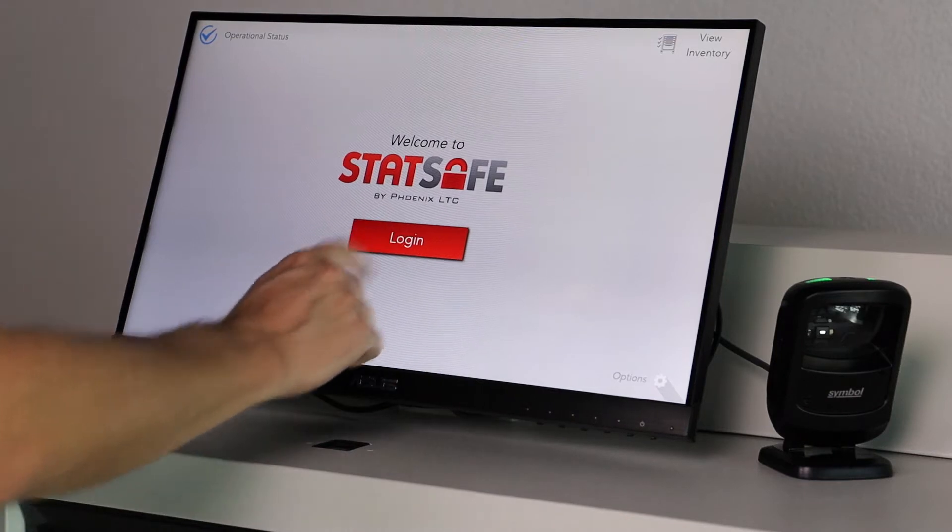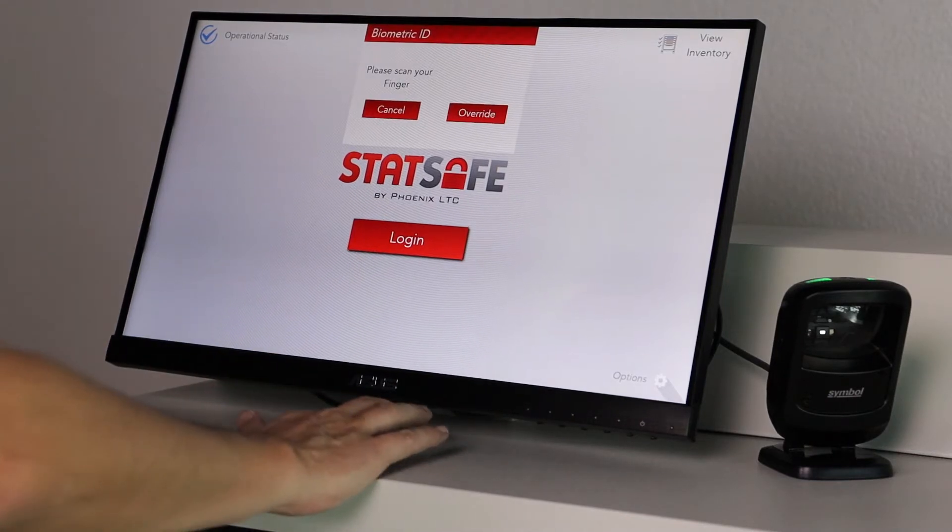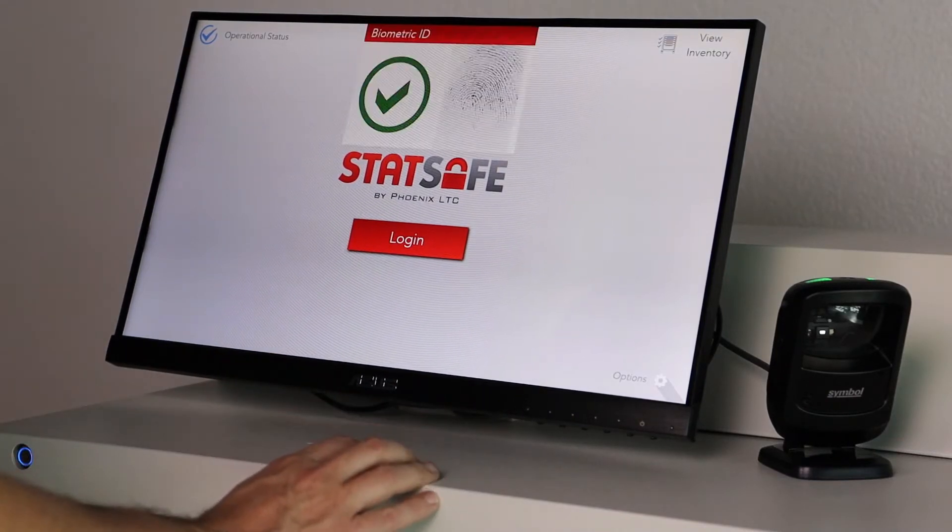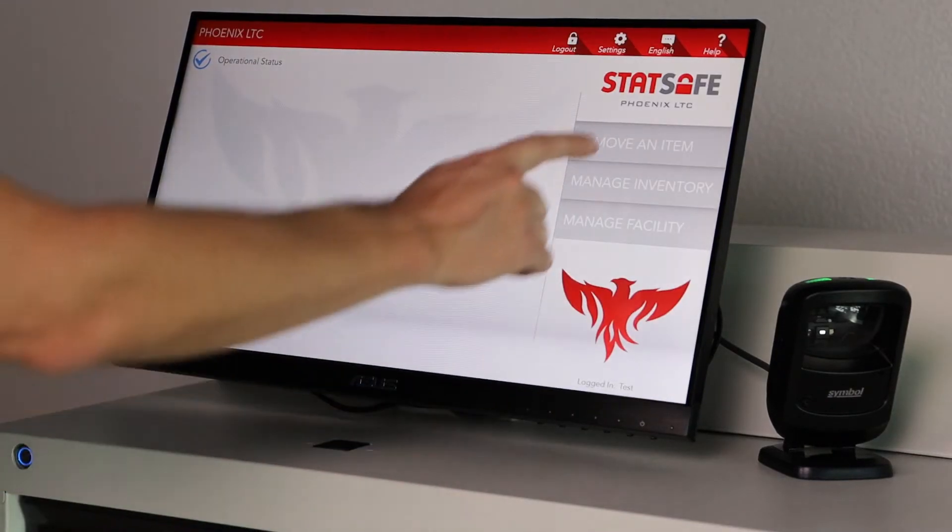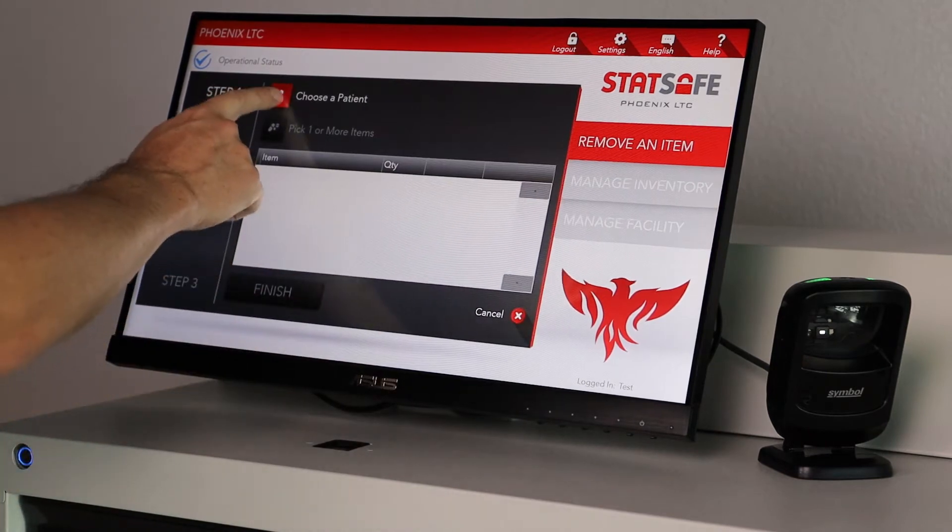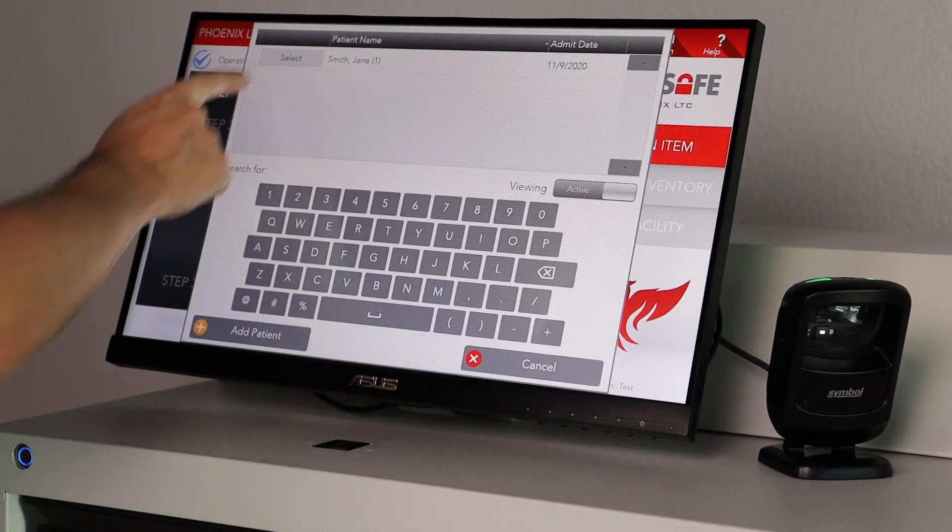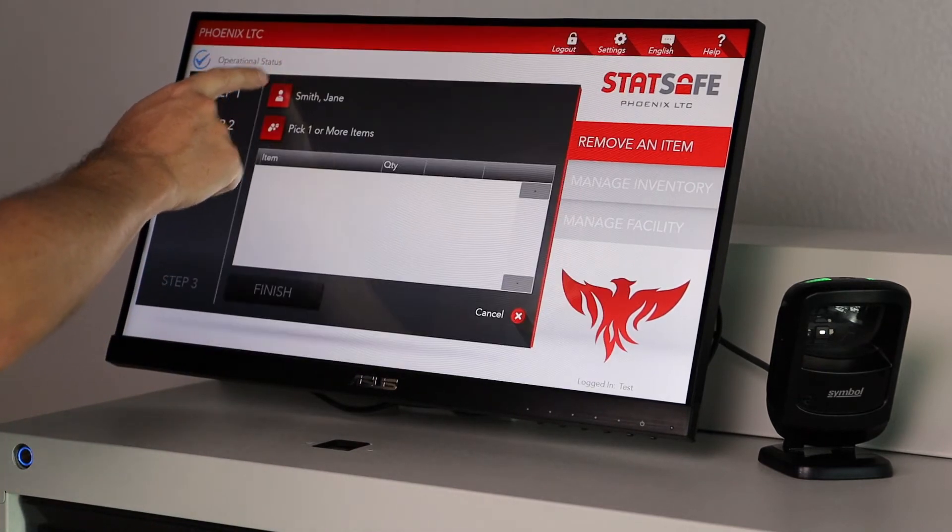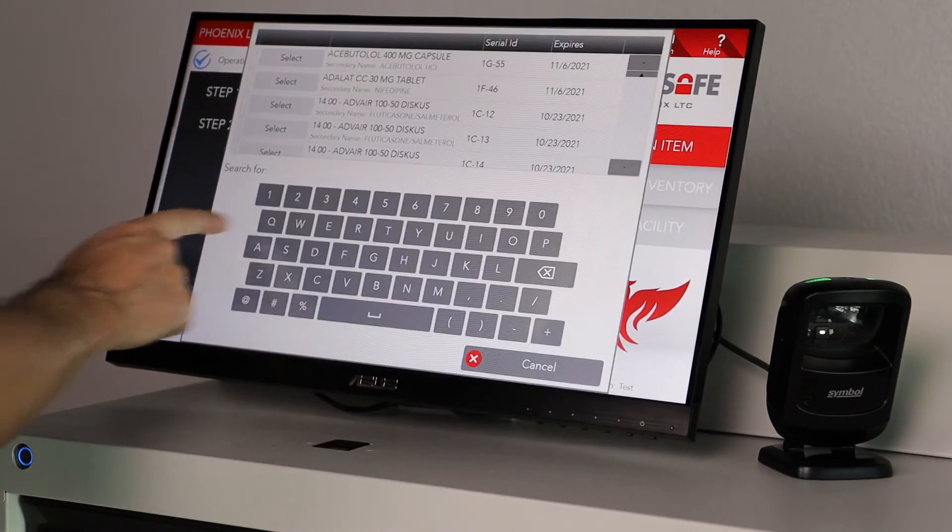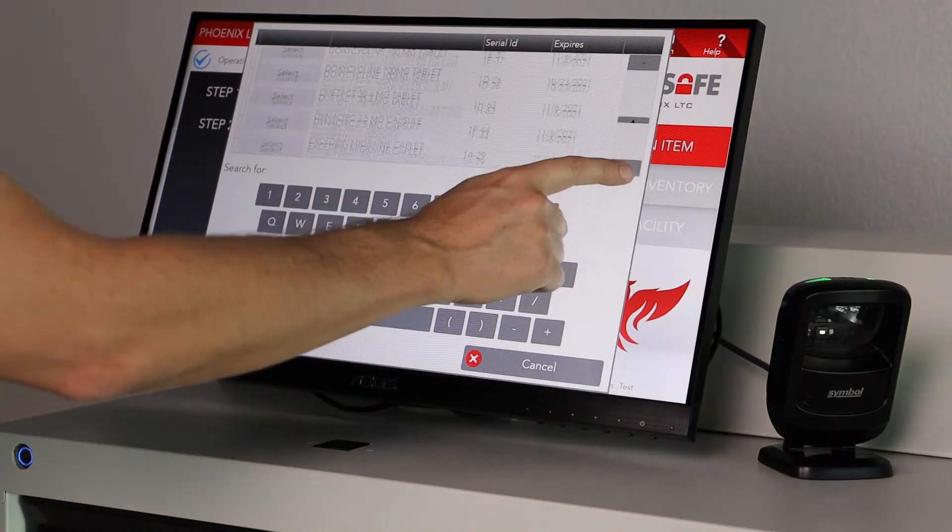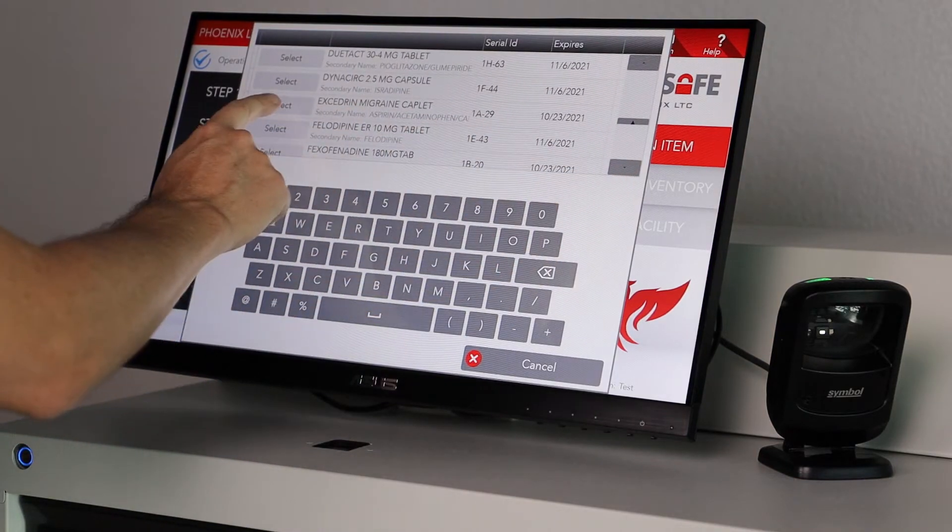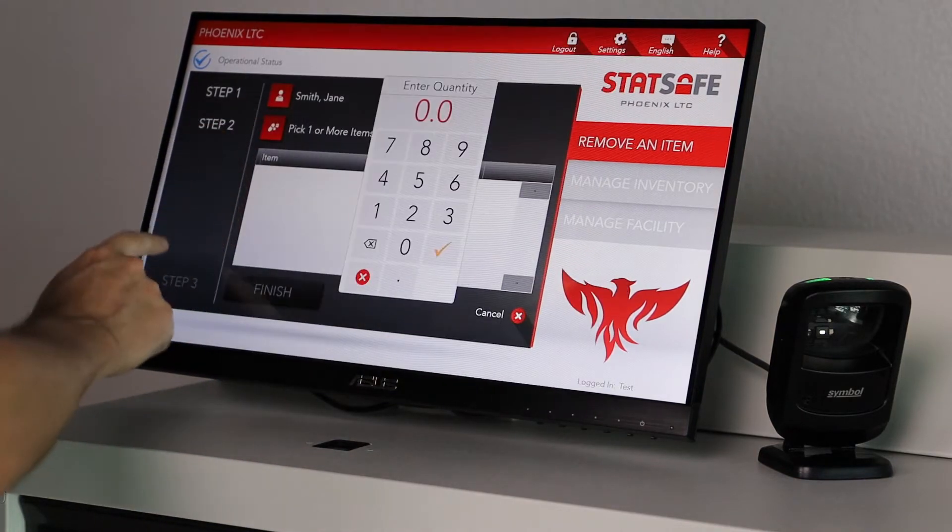Effortlessly dispense with large touchscreen. Simply select the patient, medication, and quantity.